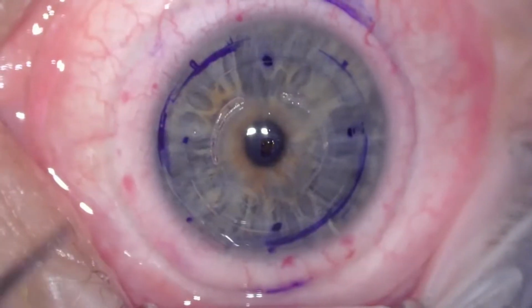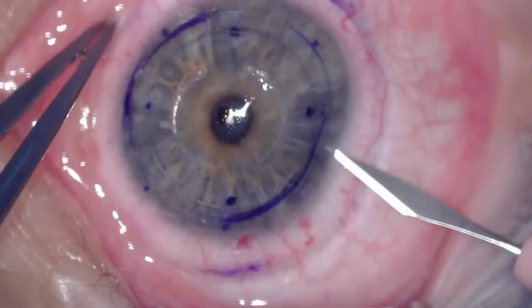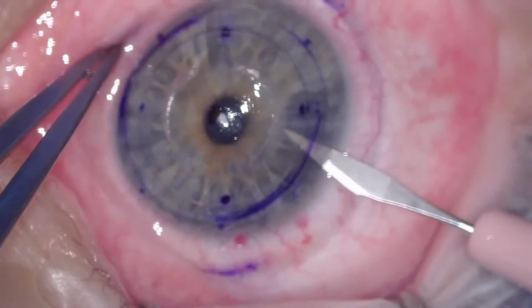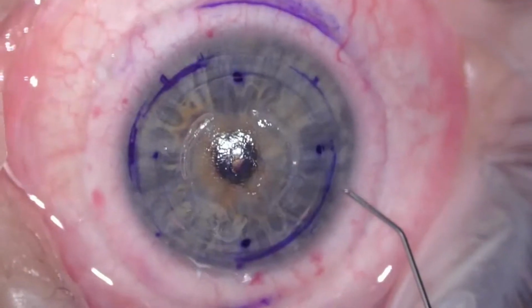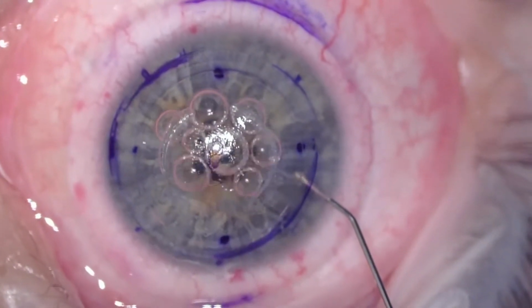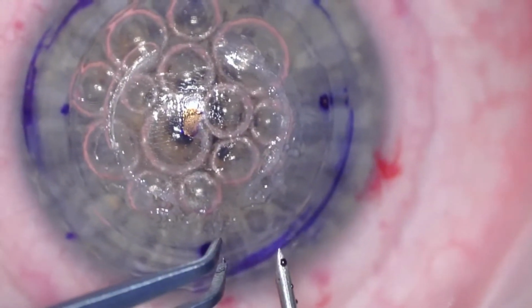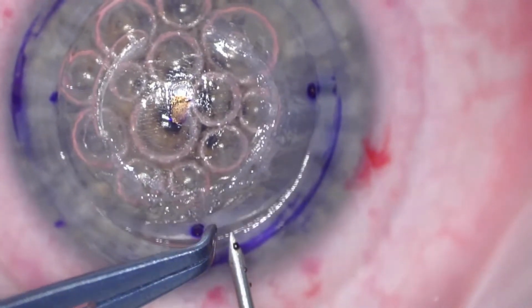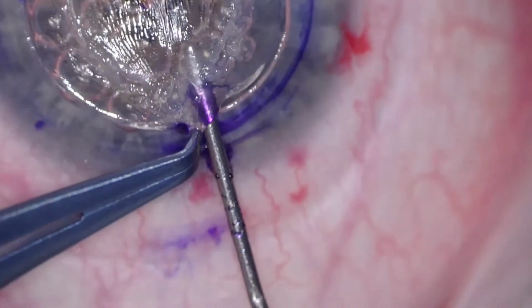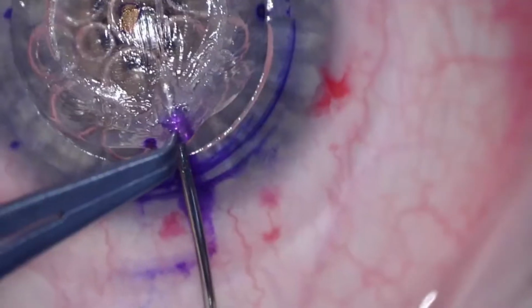Now I'm using the Sinskey just to make sure the trephination is complete, and having put a bit of BSS on the cornea to check my view again, I'm making a paracentesis, just big enough to insert some gas, some air, through a Rycroft cannula. You just need to inject a little bit of gas, a few bubbles into the AC, to help you with the big bubble technique. Now I'm focusing down, and I'm using a bent orange needle dipped in some gentian violet, just to make an entry point for the DALK cannula. I'm just going halfway through, and then I've got an ink mark of where I should go in.